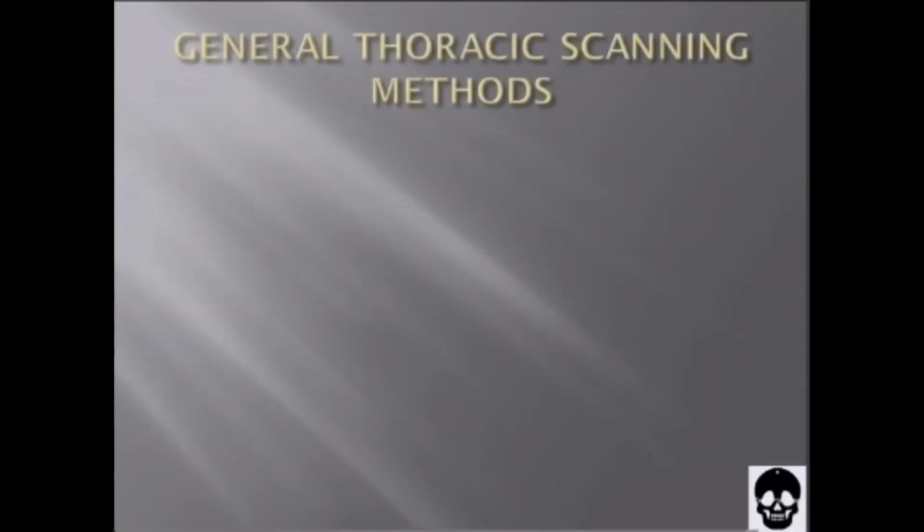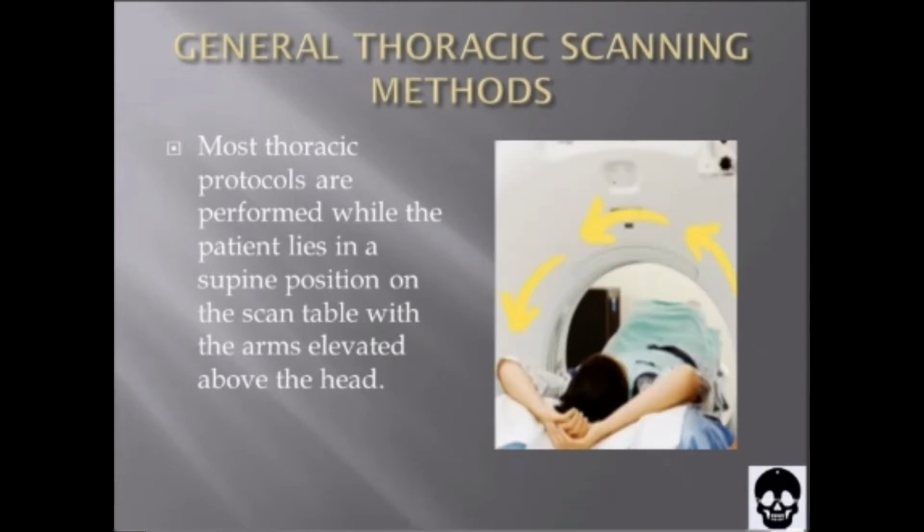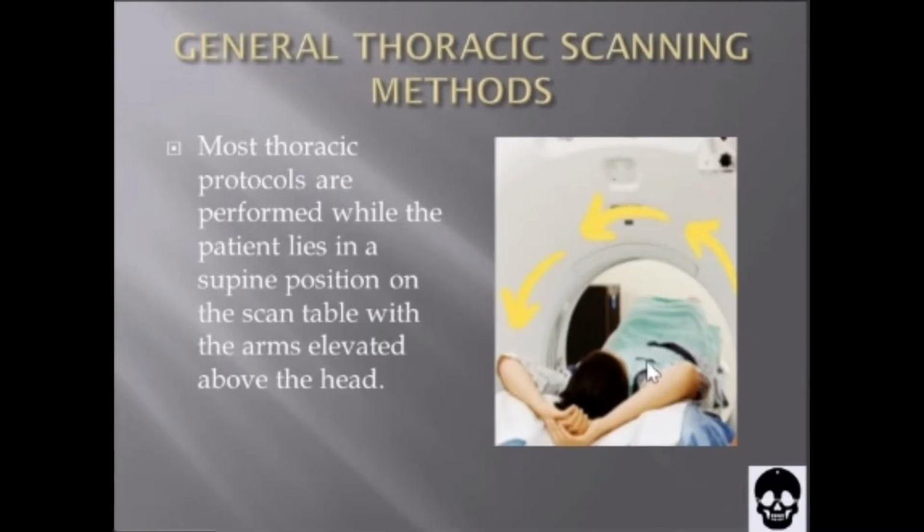General thoracic scanning methods. Most thoracic protocols are performed while the patient lies in the supine position on the scan table with arms elevated above the head. Okay, the patient is in the supine position with arms elevated above the head.